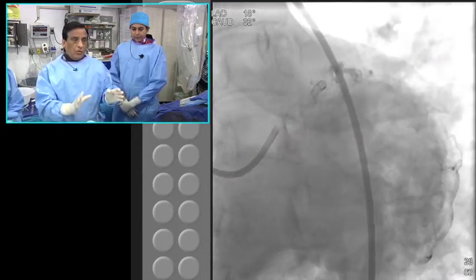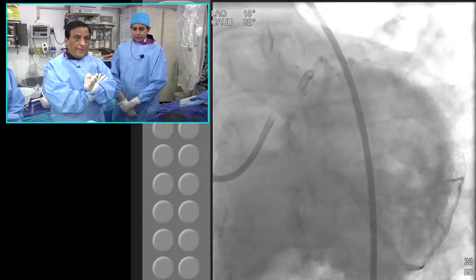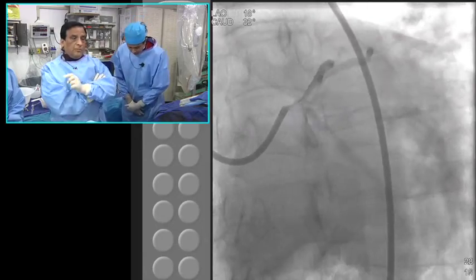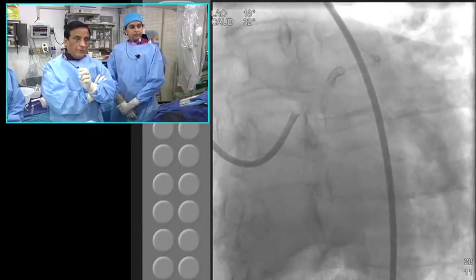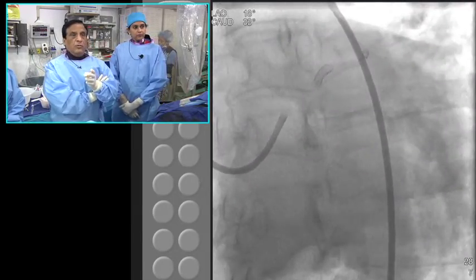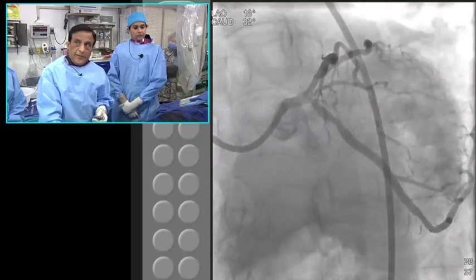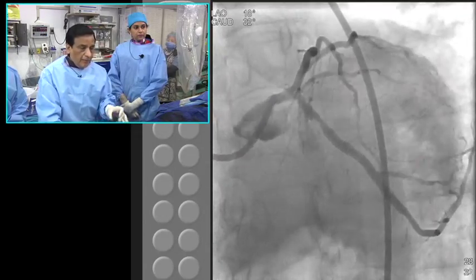With that note, we actually still carry it. Although some centers give tirofiban high doses, we use 2 boluses of Integrilin 10 minutes apart, and rarely will give an infusion. So 98% of the time it will be boluses, and of that 98%, two-thirds is only 1 bolus and the other one-third we give 2 boluses. But unlike abciximab, this is just intravenous. You're not giving intracoronary. Just intravenous bolus. Now we can complete this quickly because we're reaching our time.